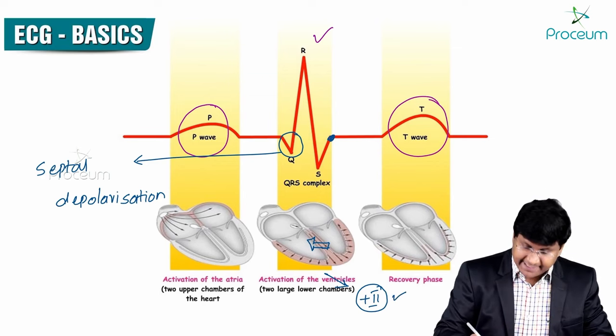Right, you take AVR, AVL, AVF, that is augmented leads. Augmented leads are unipolar leads. Let me show you that. The word itself tells you, augmented leads. That means they will just only augment, right? That means they will enhance the potential across that particular lead.